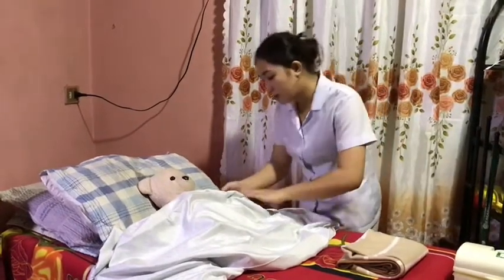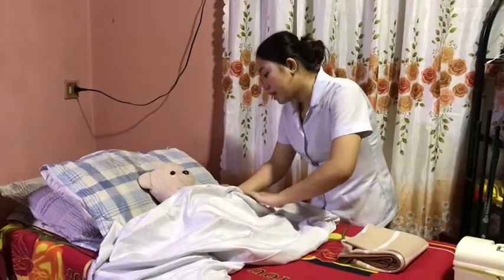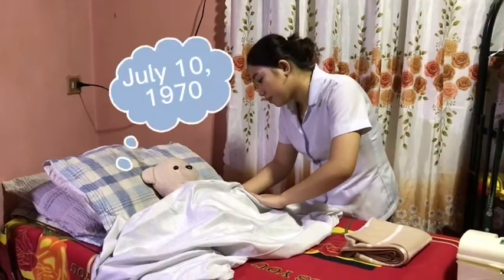Hello, ma'am. My name is Adil Zainal, your student nurse for today. May I see your wristband, ma'am? Please state your complete name. Alright, and your birthday, please.